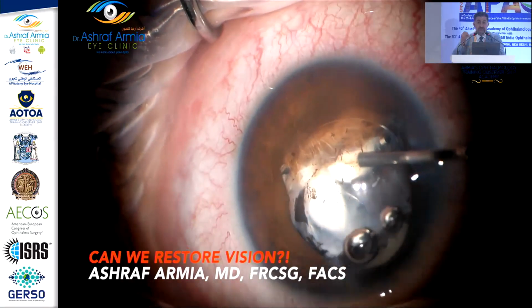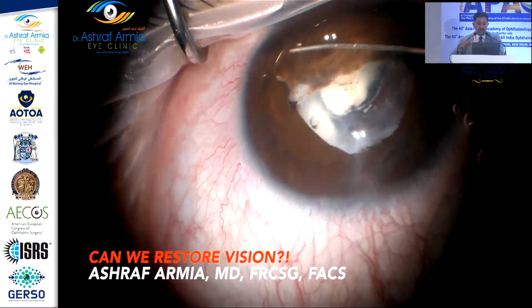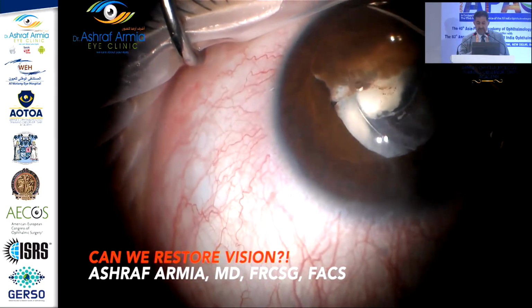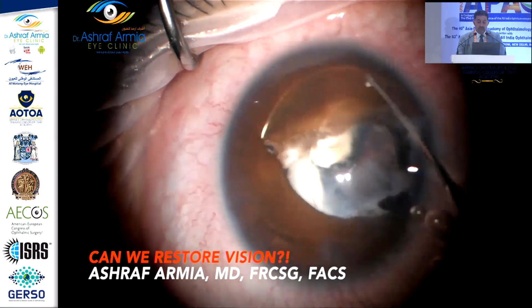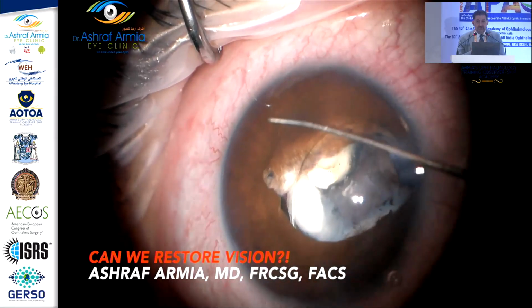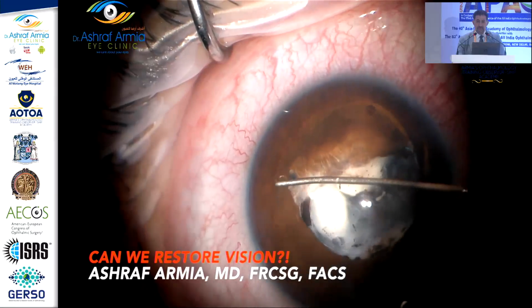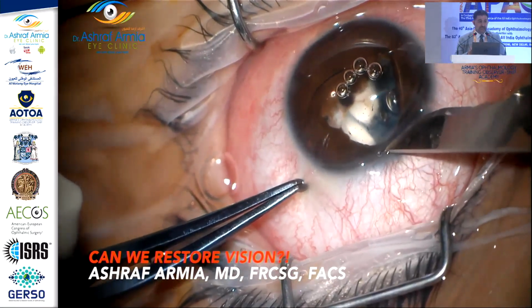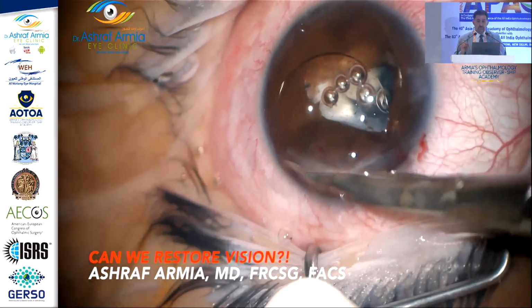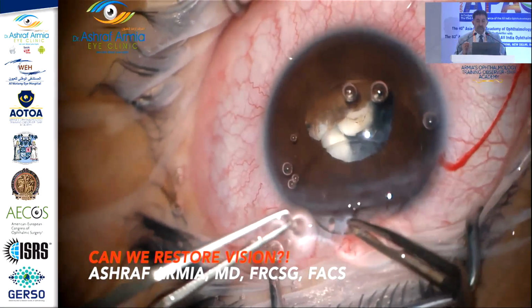So with the viscoelastic, it's the best tool to feel the eye. So inject more viscoelastic and feel what's happening inside. As I started, I'm trying to dislodge this PMMA lens without much trauma, because there is already a trauma and there are huge adhesions in the tissues. I want to reconstruct the anterior chamber and reach a good size of the pupil.